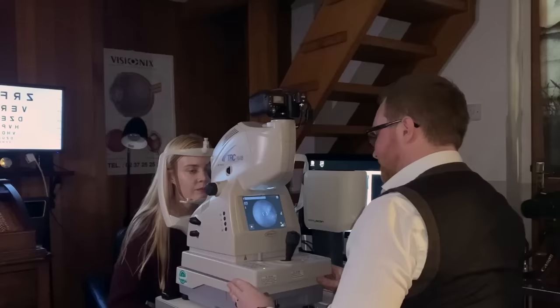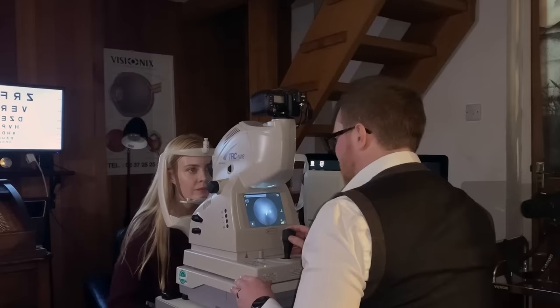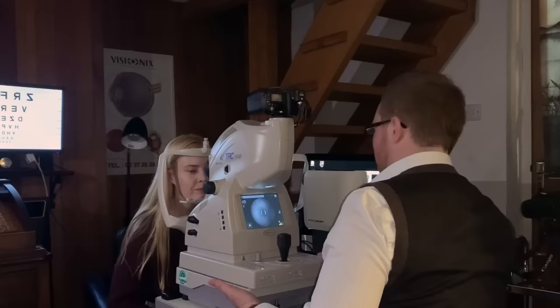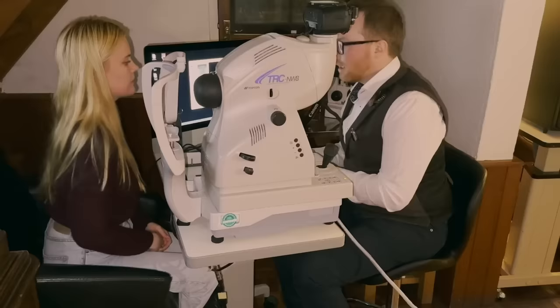And again, this eye, just looking at the little light in front of you there. Sometimes it looks like it's hovering outside the camera, it's perfectly normal. And a flash of light. Very good, and you can sit back. We'll have a look at those in a second. What we'll do first is get the images with the other camera. There we go. Bring that chin rest up.